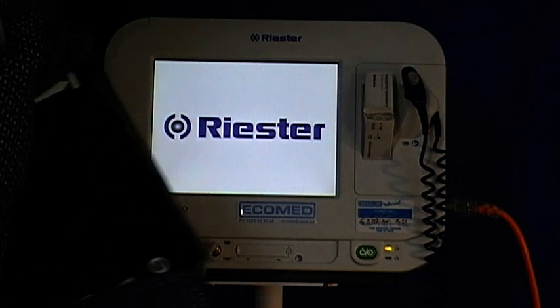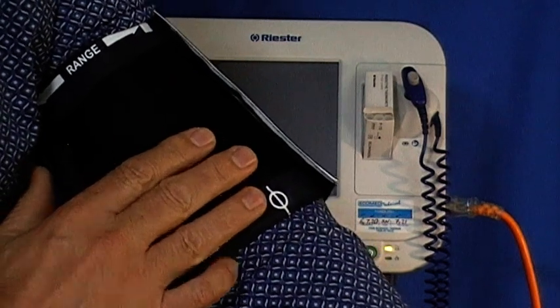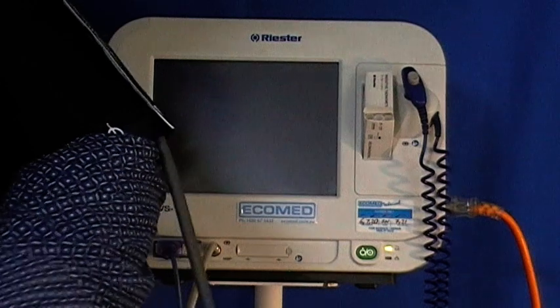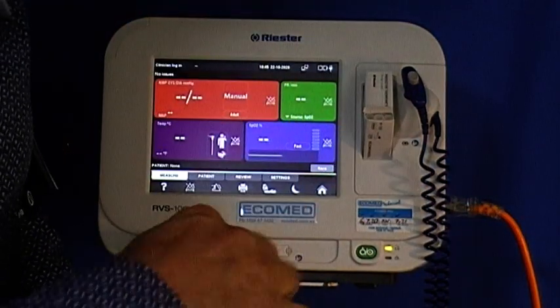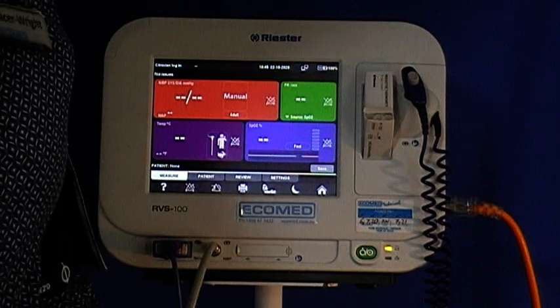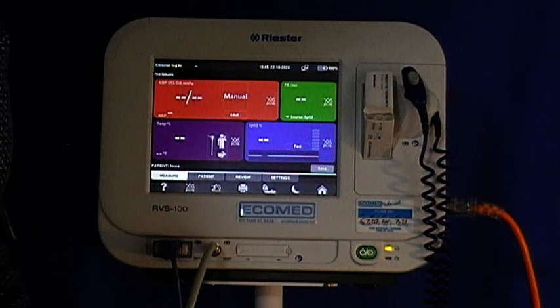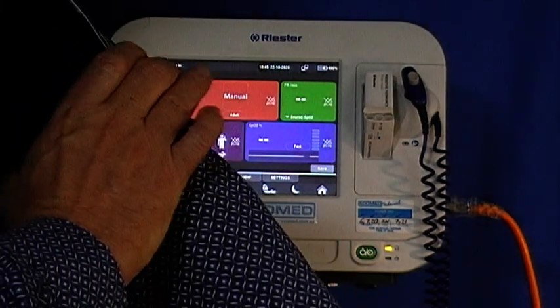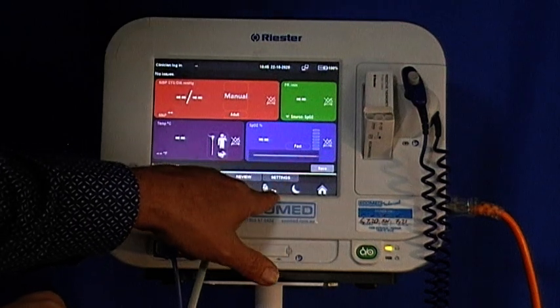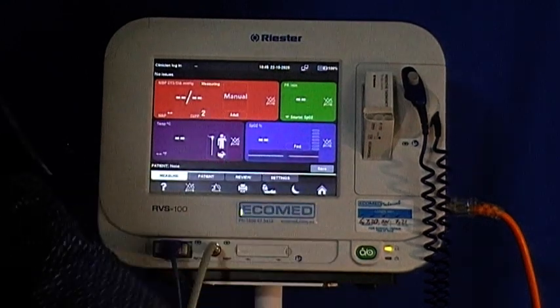I have placed the NIBP cuff on my arm in the correct position for automatic blood pressure measurement. Ensure that the tubes are connected to the device to be able to get accurate readings. For measurement of NIBP, the patient should be seated or lying down, and the icon at the bottom of the screen with the arm is to be pressed to start.